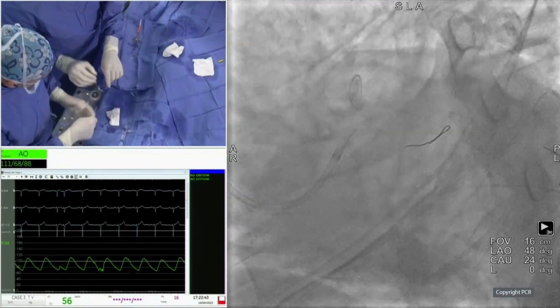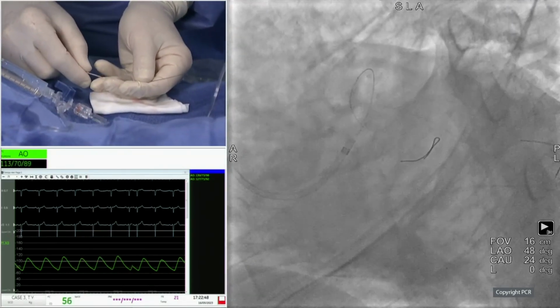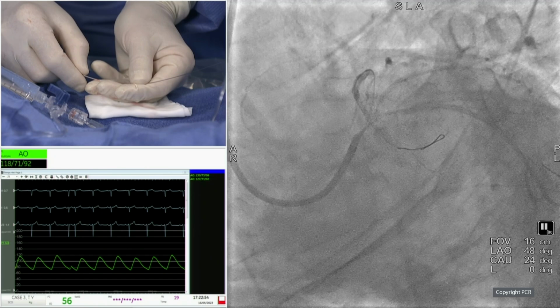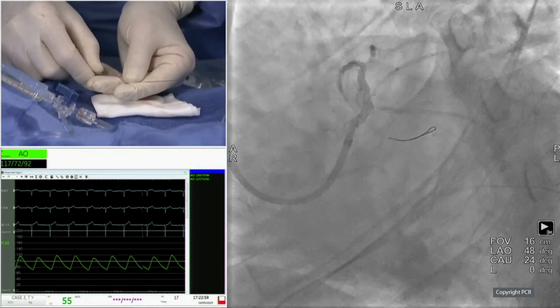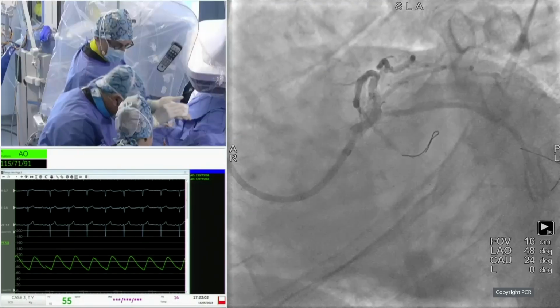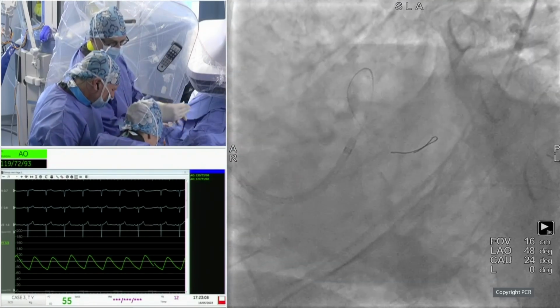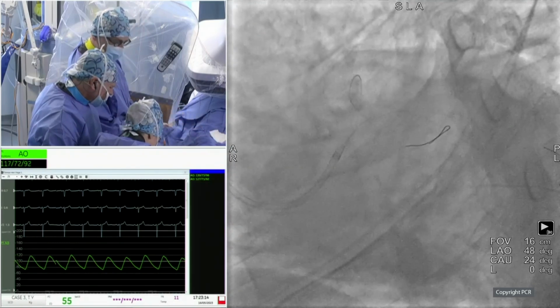Okay, put the stent. While they are wiring, I think that without any conflict of interest, we can say that the shockwave is really making a major entry in interventional cardiology. And for those who are a little bit interested in the marketing aspect, there is a battle right now between Boston, Johnson & Johnson, and Medtronic.